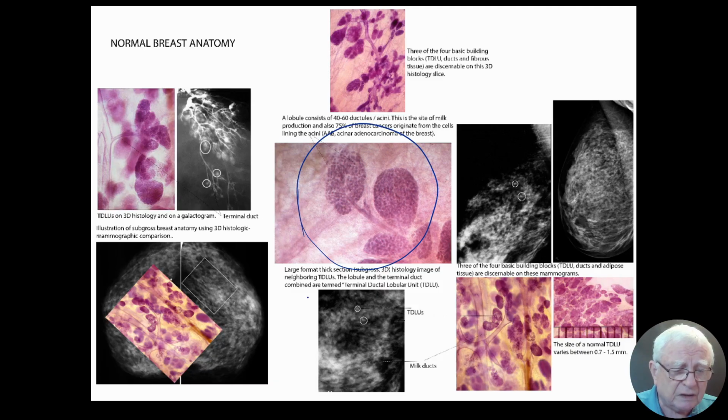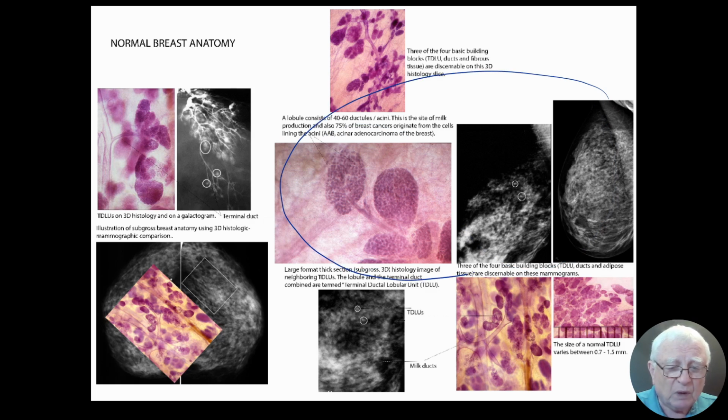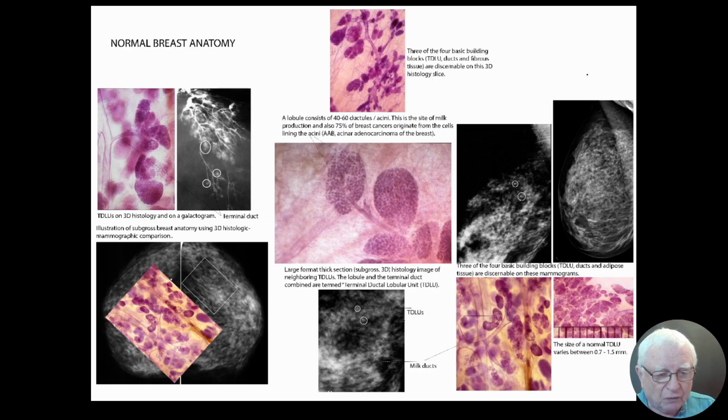Histology is not an entity by itself. Mammography or ultrasound or automated breast ultrasound, MR, and so on are not separate entities. We have to work together. And for that, we have to understand the 4 basic building blocks. And dear colleagues, they are right in front of you. I'm going to talk a lot about the so-called 3D pathology.